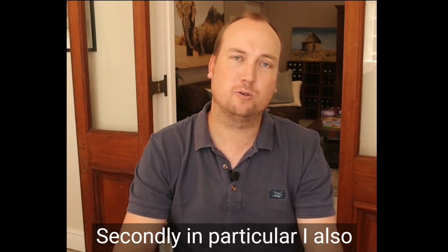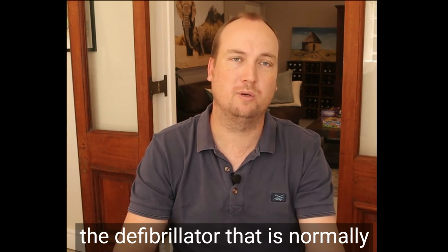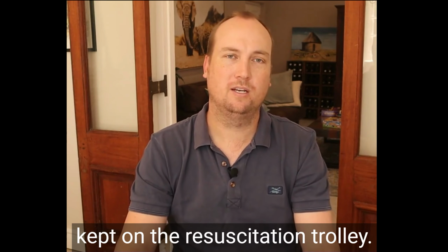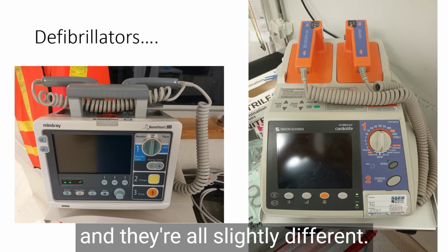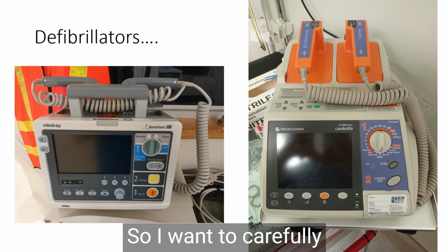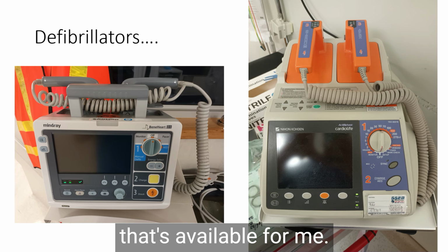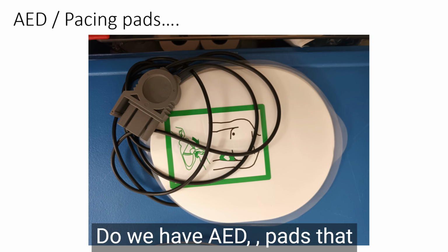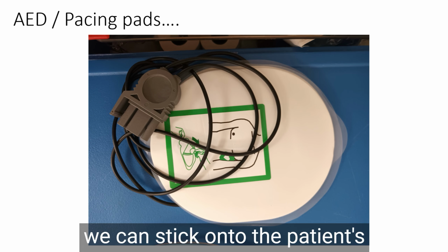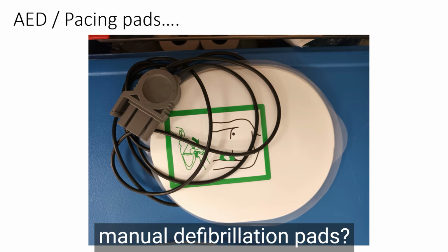Secondly, in particular, I also want to be very familiar with the defibrillator that is normally kept on the resuscitation trolley. This is because there are lots of different makes of defibrillators, and they're all slightly different. So I want to carefully inspect the defibrillator that's available for me, and I want to know, do we have defibrillator jelly? Do we have AED pads that we can stick onto the patient's chest, or do we have to use the manual defibrillation pads?